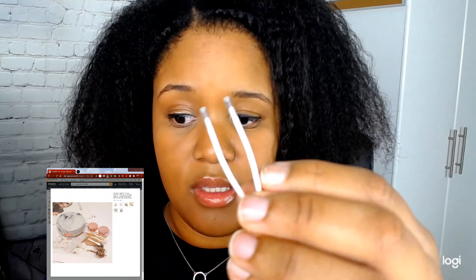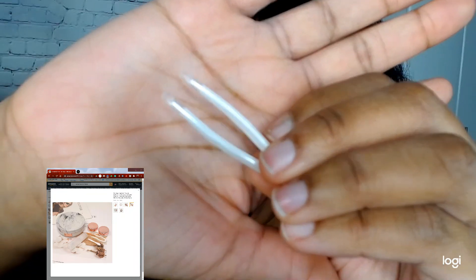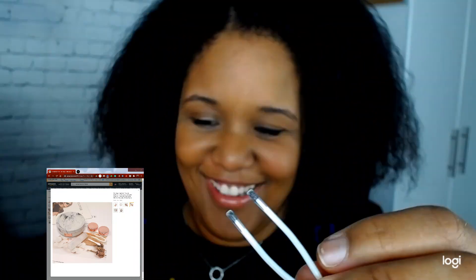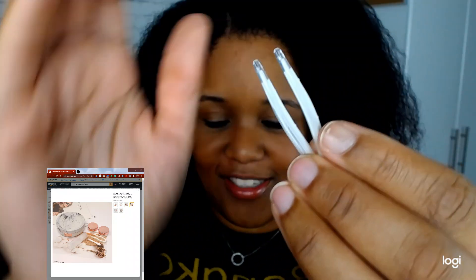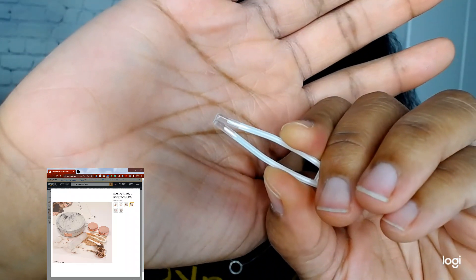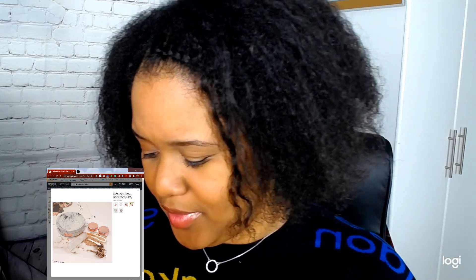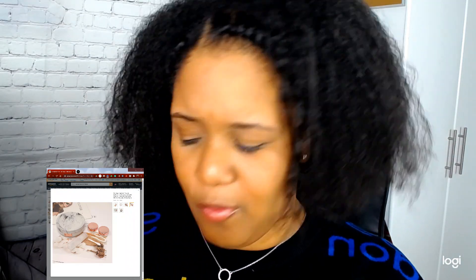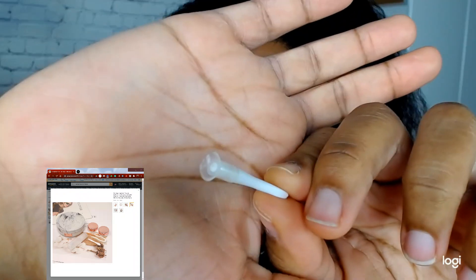I had to do the YouTube thing. So this is the applicator — it has little soft tips at the ends. You can pull your contact out with it. I've already wiped everything down and washed my hands. This is the applicator to put in the contact — it has like a little suction thing.